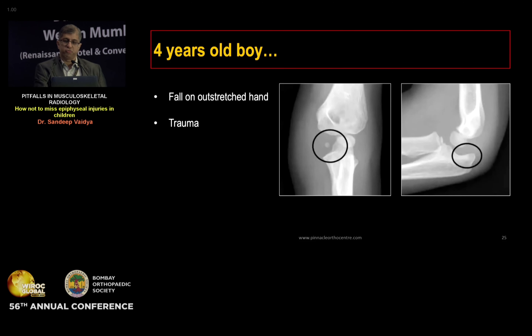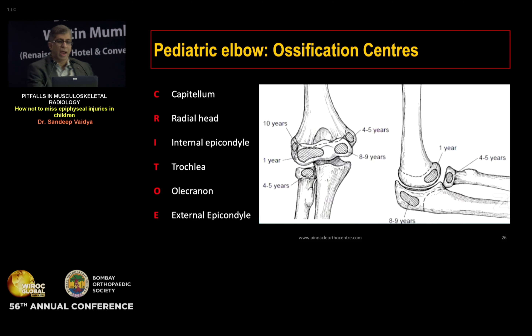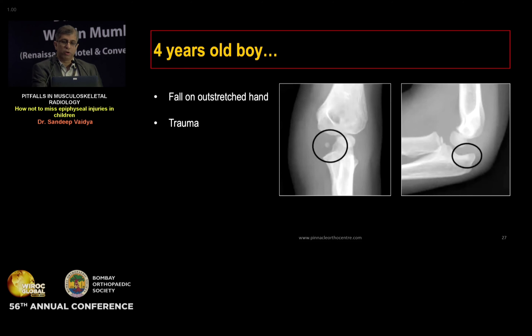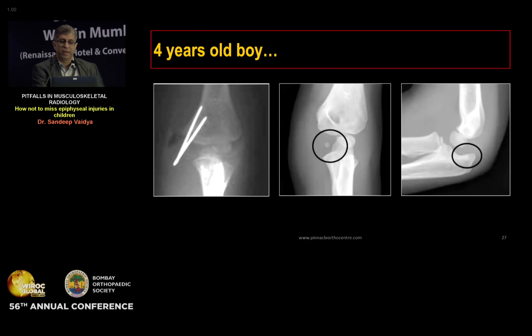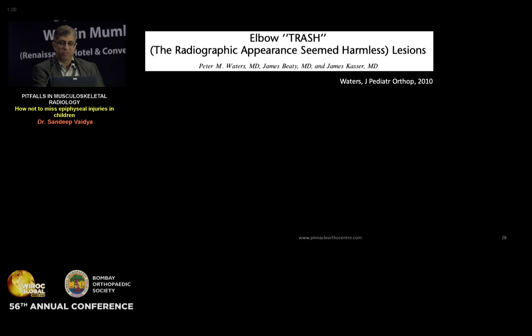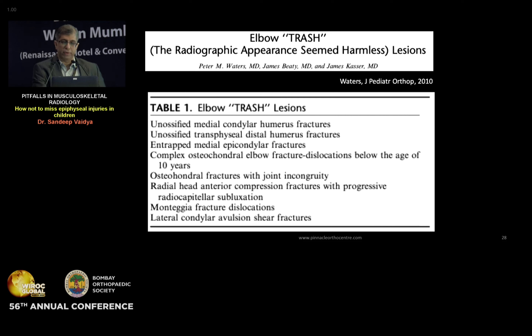Another example: a four-year-old boy with fall on outstretched hand shows an ossification flake within the ulnohumeral joint. This might be thought of as the trochlear ossification center, but the trochlea ossifies only around age eight to nine years. In a four-year-old, this cannot be the trochlea; advanced imaging reveals an entire medial condyle fragment requiring open reduction and internal fixation. The elbow is especially notorious for fracture misdiagnosis. A group of such injuries is termed TRASH lesions — an acronym for The Radiographic Appearance Seemed Harmless — which cannot be diagnosed on X-rays as they pass through cartilage.